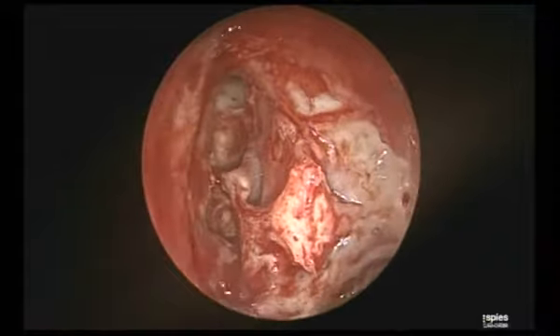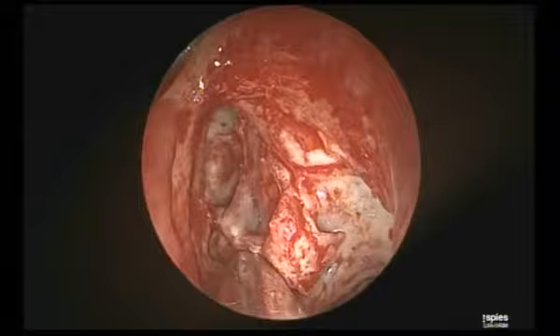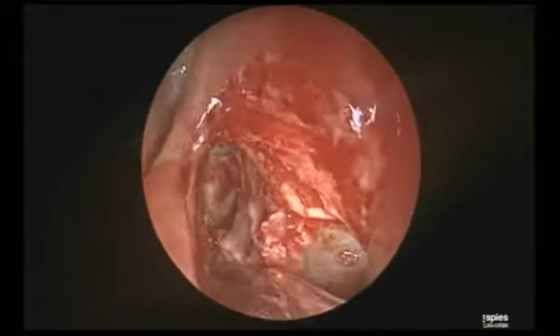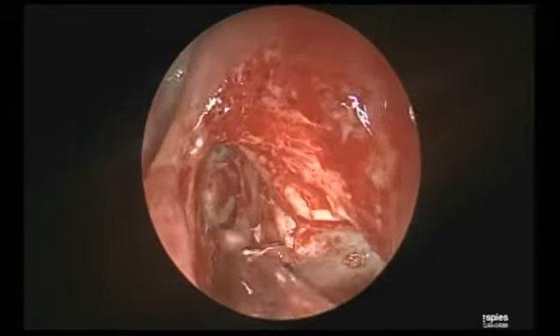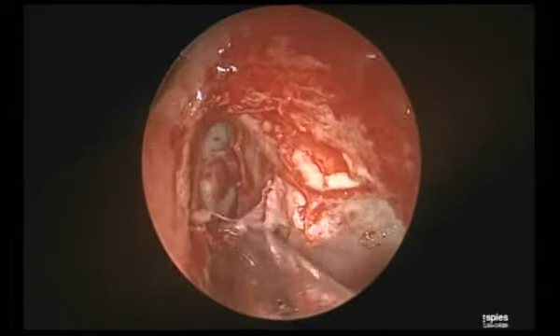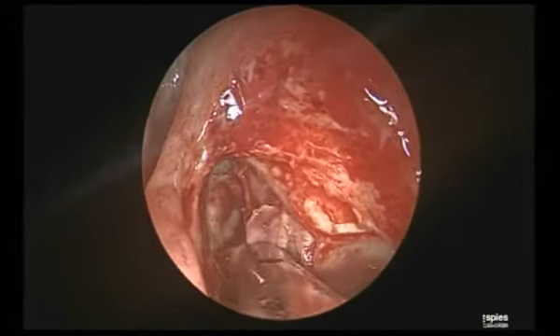So now I like how Ashish said, now this bulla is garbage. We can remove it, and the only thing to be careful about is the lateral aspect, because the lateral attachment of the bulla is the lamina papyracea. So that's what you ascertain, that it is not eroded in this pre-op CT.